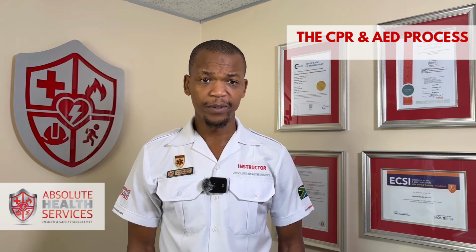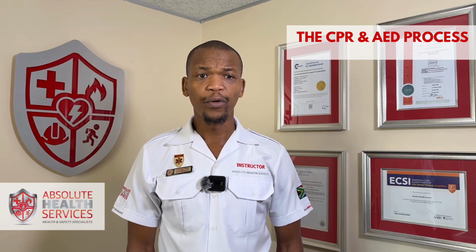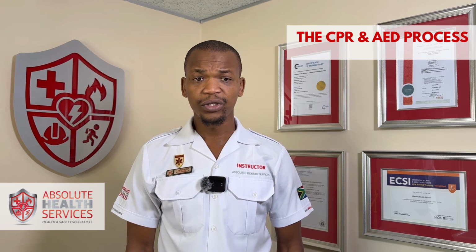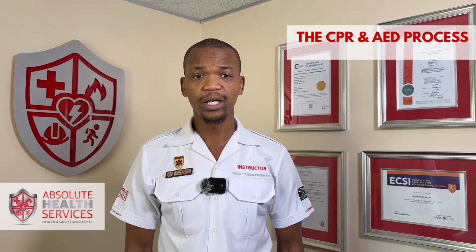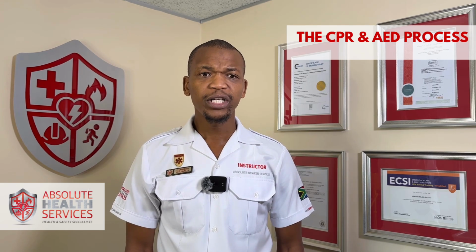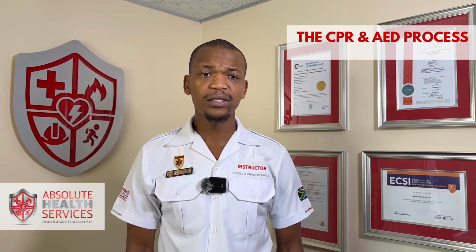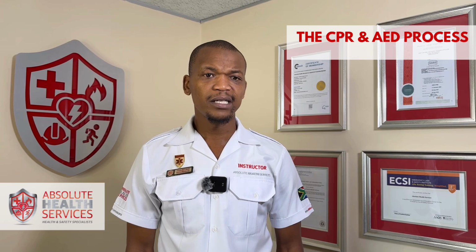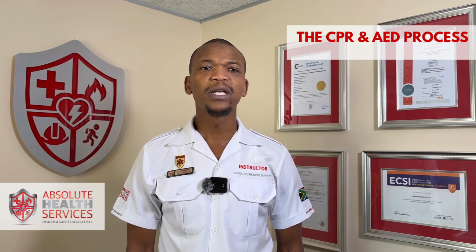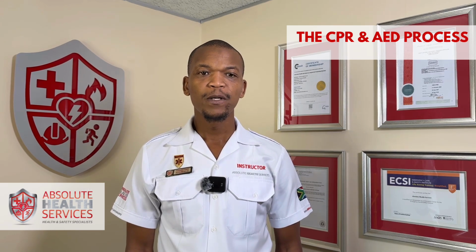When you start performing CPR on a patient who has suffered cardiac arrest, you are going to check the pulse, the carotid pulse, mainly with adults and children. With infants, you can check the femoral pulse or the brachial pulse. While you are checking the pulse, you also check if the patient is breathing by looking at the rise and fall of the chest for 5 seconds, no longer than 10 seconds. Without a pulse and breathing, you will immediately start with chest compressions 30 times, followed by 2 ventilations, and you repeat this for 5 cycles.